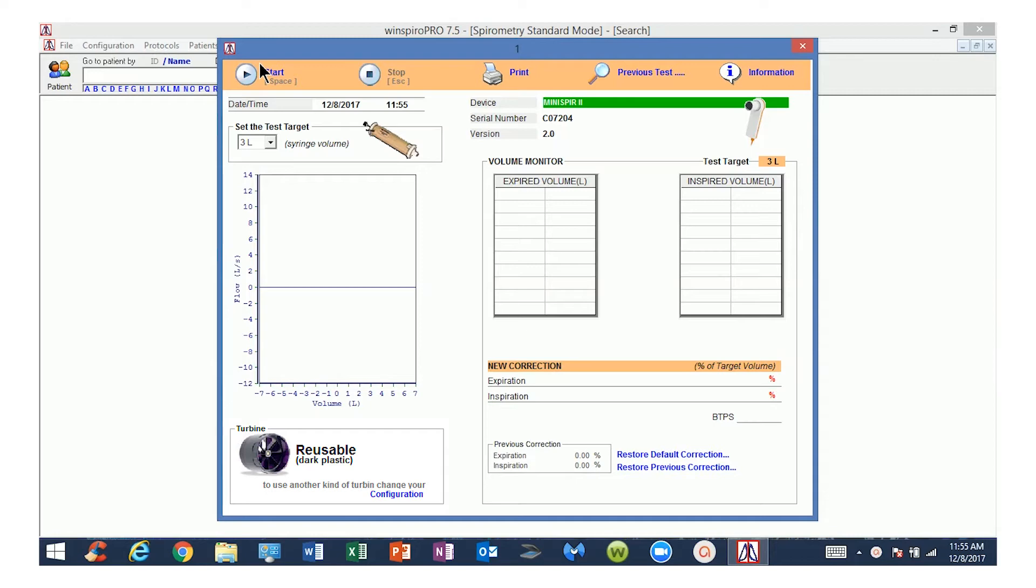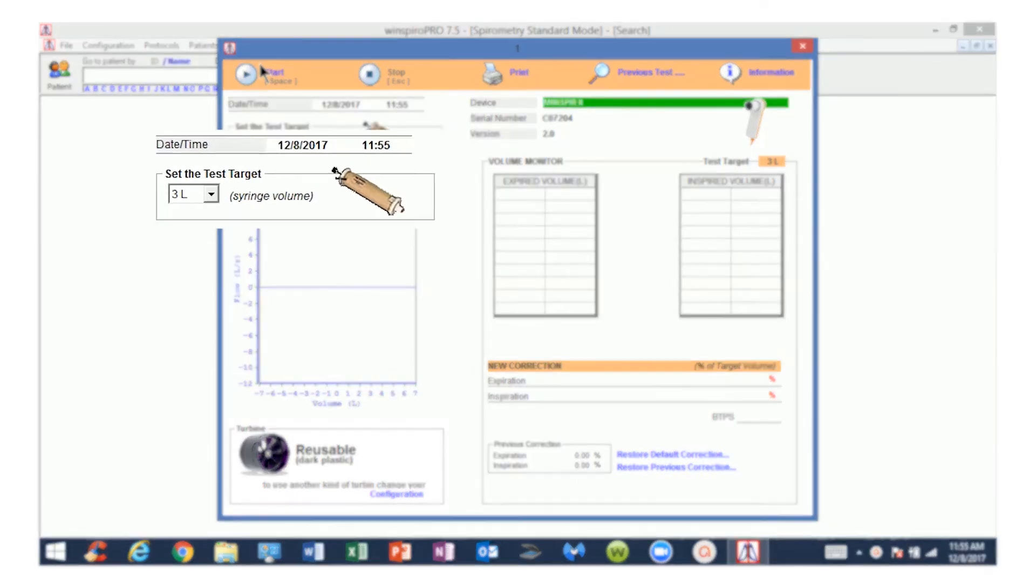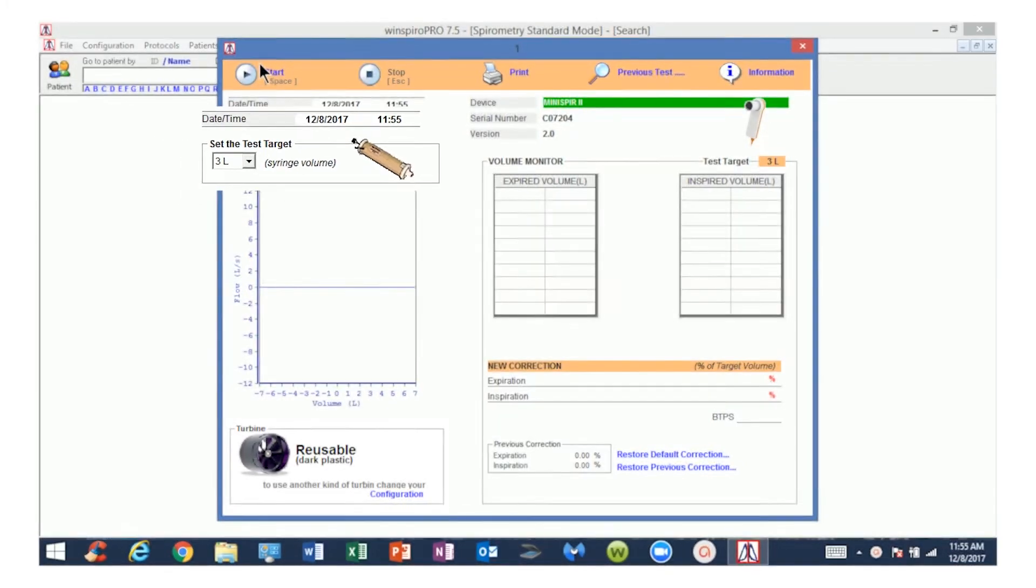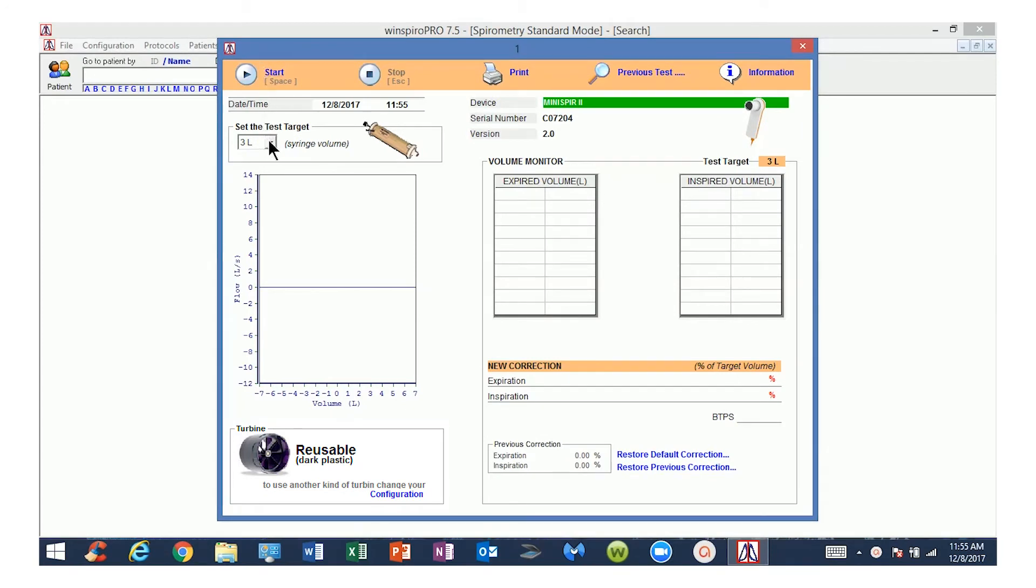Below the row of icons on the calibration test screen, you will see the date and time automatically entered. Below the date and time, you will see the Set the Test Target. From the drop-down arrow, select the volume of the syringe you are using.